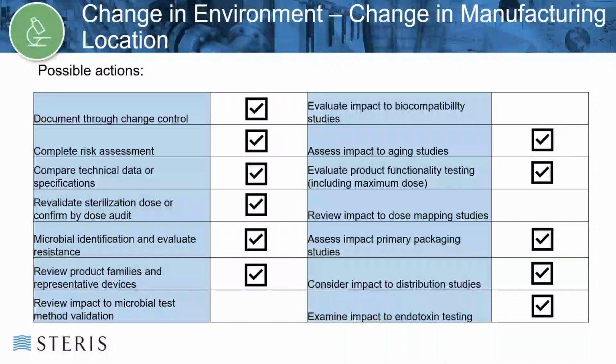The change, again, should be documented in a formal change control. A risk assessment could also be useful to document the impact of the changes. Review of the classification of the cleanrooms, associated particulate and biological environmental data could be a useful exercise in understanding the impact to product associated with the change.